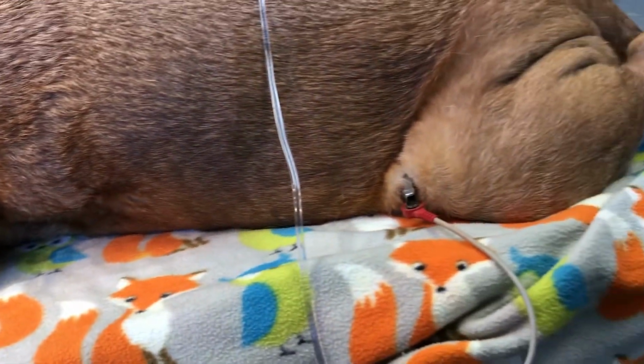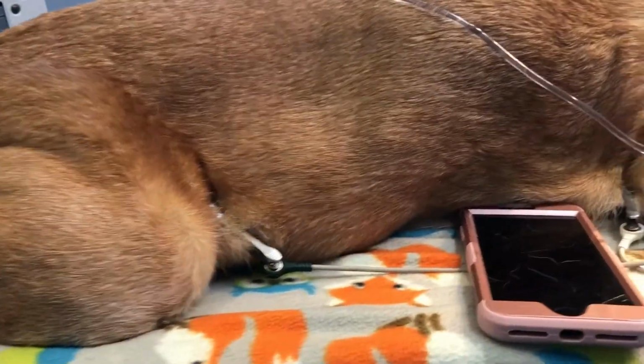As far as placing the leads, you always want to try to make sure that your white one is on your right arm, your black is on your left arm, and your red is on your left leg. In my video, we use all 4, and we put the green on our right leg.